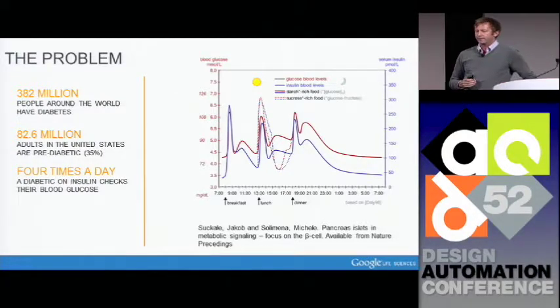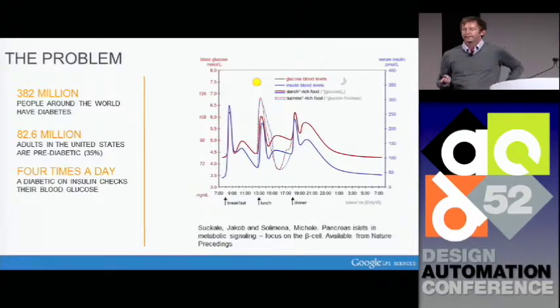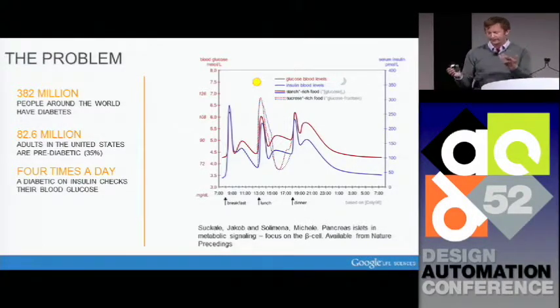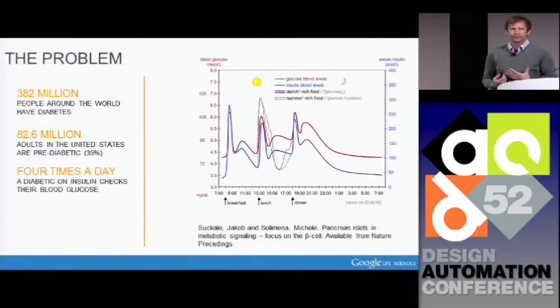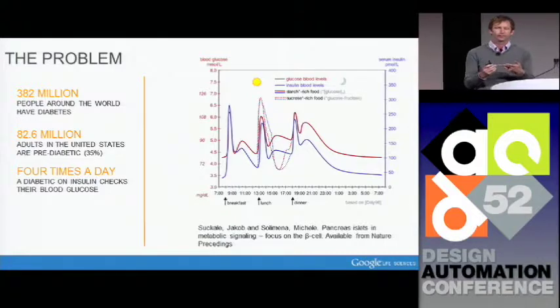Well, the diabetes technology community has risen to the challenge and has created continuous glucose monitors that will ideally give you continual access to blood glucose information. But these devices are essentially the instrument that you'd use to test a finger prick drop of blood that's attached to your body with a small needle that's placed under the skin. You can imagine that's extremely valuable if your life depends on accurately tracking this data, but it is not a pleasant device to wear. It's not pleasant to prick your finger.